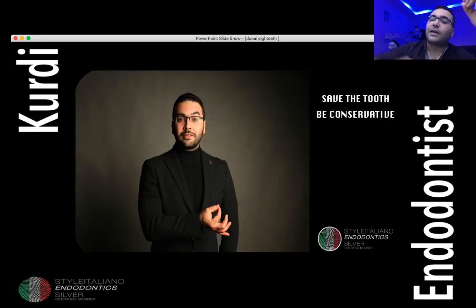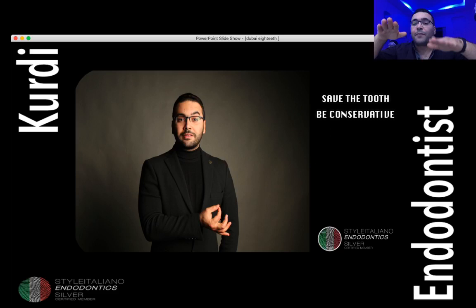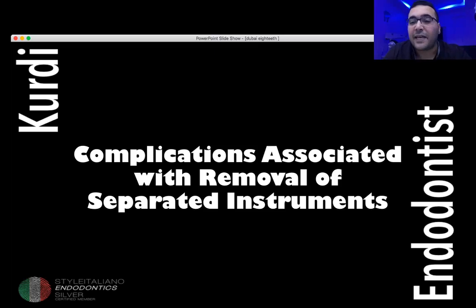So you can just remove the file, and you do not remove a lot of dentin. This kind of retrieval protocol is very conservative. And as I said, you have to have this kind of balance. You remember the elephant standing on the ball. You have to have this kind of balance in your mind. You have to remove the harm, remove the separated instrument, but also you have to save the tooth and not remove a lot of dentin, because we have a lot of complications associated with the removal of separated instruments.